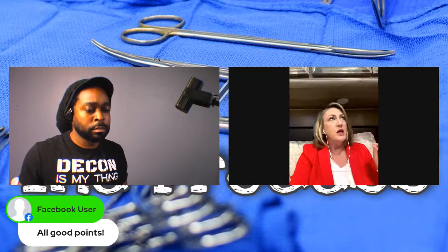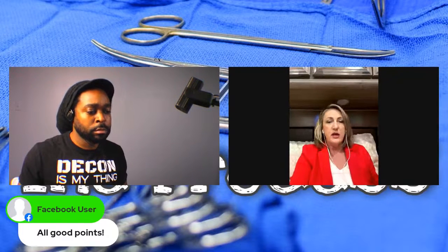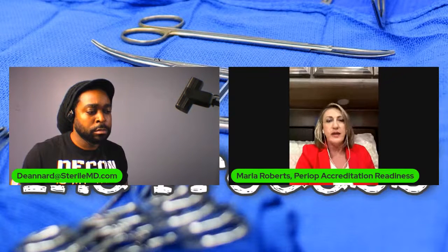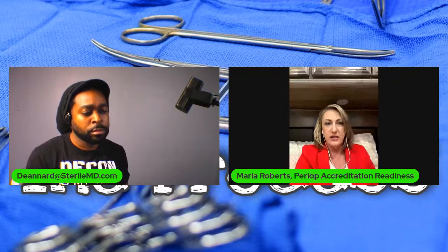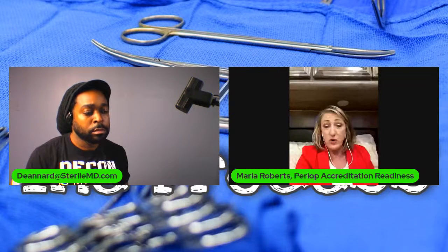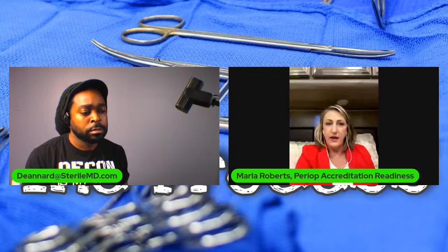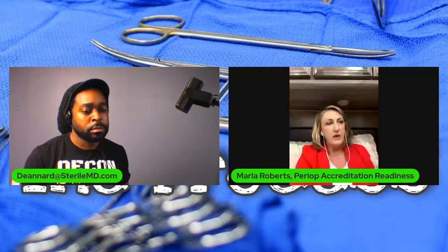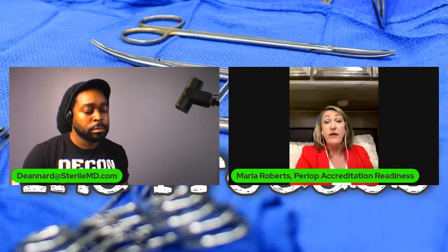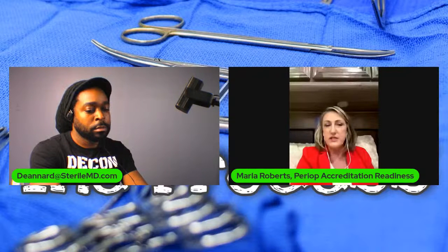So if you have a problem in SPD, then you're going to get an environment of care. So say you have poor lighting in there, and you can't see to do your job. You can't see if the things in the sink are clean or not. Or you don't have a borescope to check the lumens. So if you don't have that, they can write you up for infection control. Like, say you don't have the borescope, or you bought a new robot, but you don't have the ultrasonic cleaner to clean it in. So they're going to write you up for infection control.